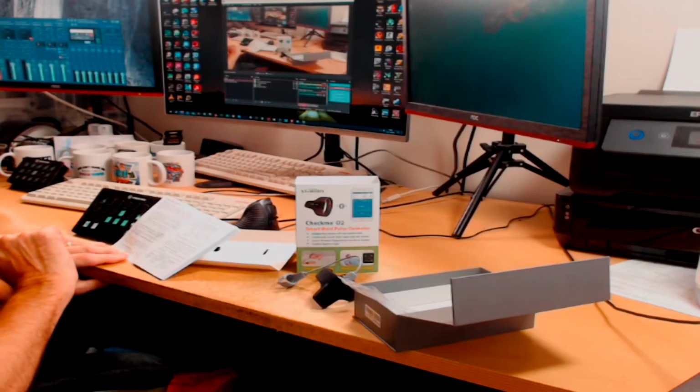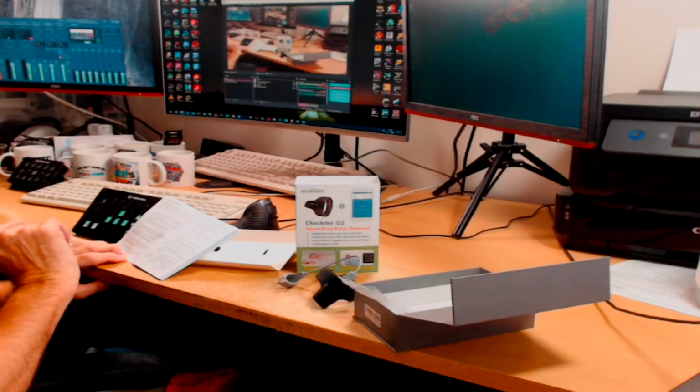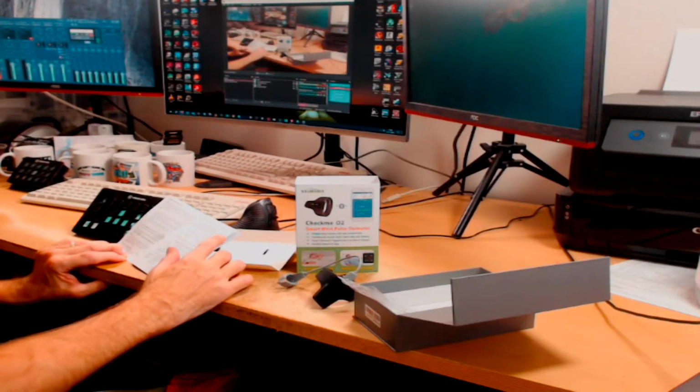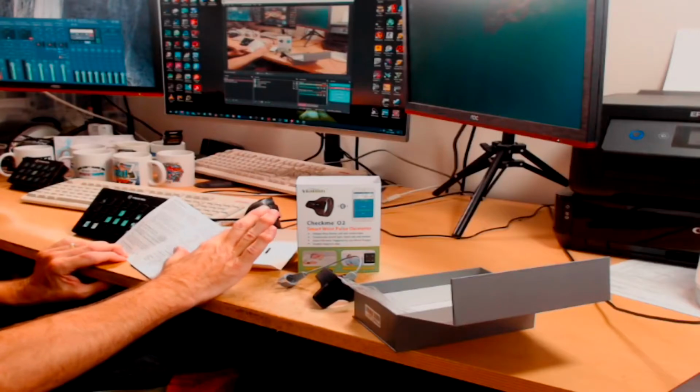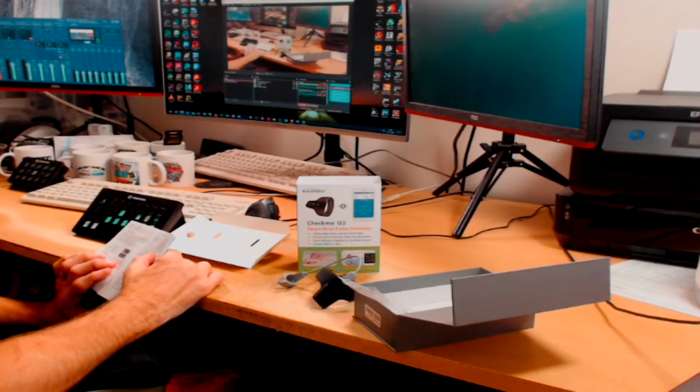See, I'm not sure if I'm doing it correct because I didn't get anything come up this morning. I wanted to have a look and see what the ratings were during the night, and there was nothing that I could see on the app. So I'm going to have to read this manual. There is a smart vibration, so if it goes below your threshold, it will vibrate on your finger, and this is designed to wake you up.